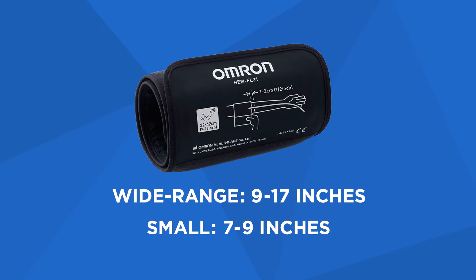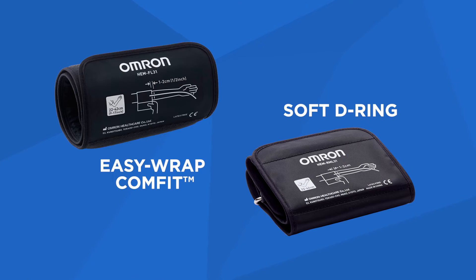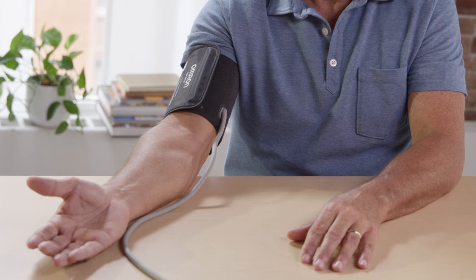Most Omron blood pressure monitors come with a wide range cuff which fits arms between 9 and 17 inches. There are two types of cuffs. The EZ-Wrap Comfit cuff from Omron features an exclusive 360-degree accuracy cuff. It inflates around your entire arm, making it easy to get a reading on either arm regardless of how you position it.